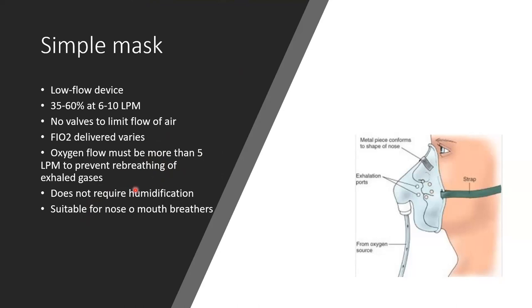All right. So the other advantage of a simple face mask is it's suitable for patients who are mouth breathers as well as nose breathers. So those would be the reasons why we would use this device. Let's move on. But before I do that, let's see if you have any questions. Do you have any questions?